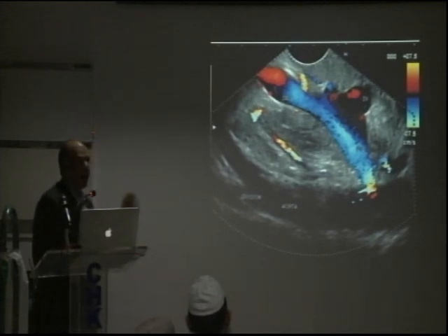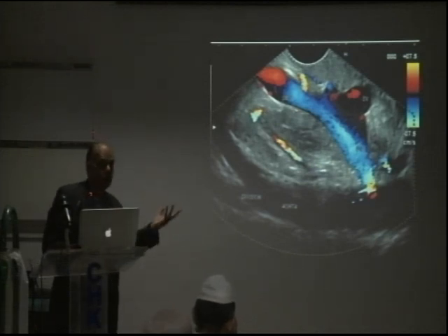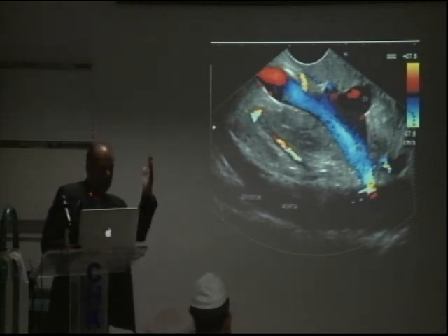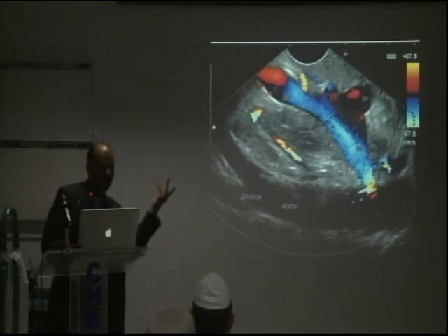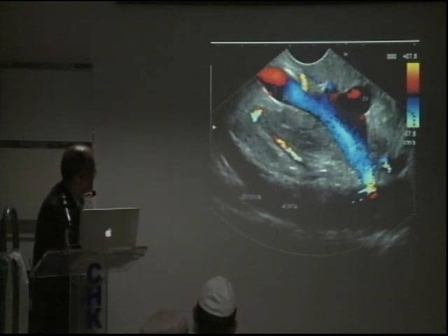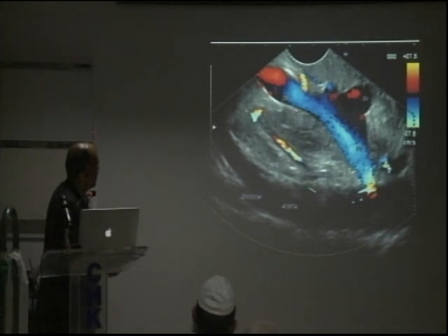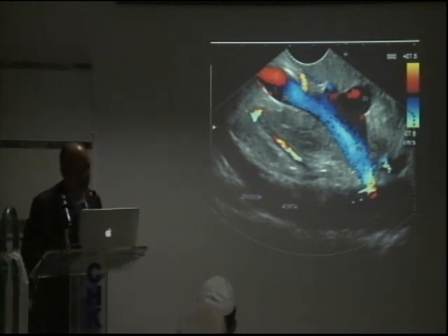All right? So that is also the reason I want you to understand this concept. That is also the reason that it gets flipped in the D1 and D2. So you go up like this, it actually flips the picture, and your bile duct is actually on the opposite side, and the portal vein is on the opposite side. We'll not go into this because this is for advanced. Because for the same view, if you rotate the scope like this, you can actually get the aorta, the gonadal, and also the pancreas, but we'll not go into that.